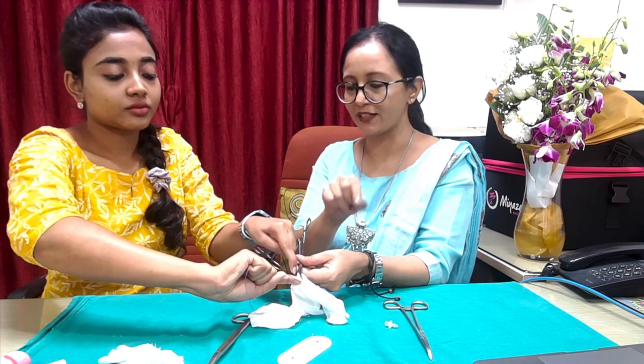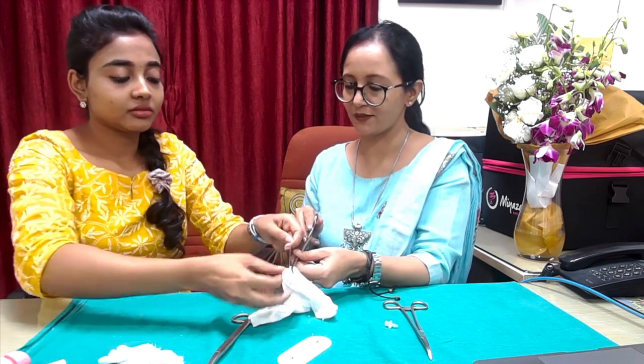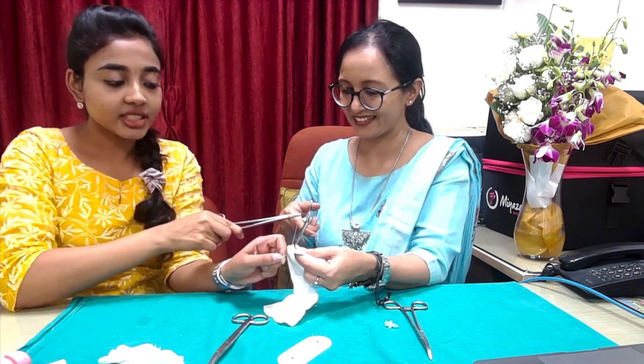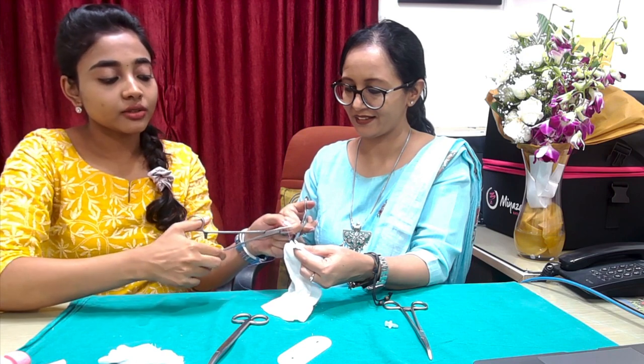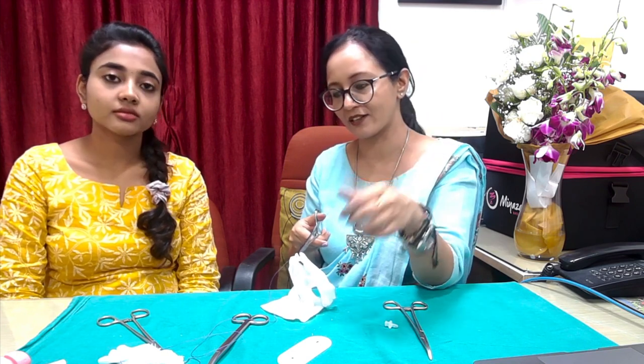Tighten the knot while placing your index fingers on it. Release the clamp simultaneously so the pedicle gets tightened. Give the knot a memory — count to 4 or 5. Without releasing traction on one end, place one more knot. The traction is still maintained on the knot, then rotate the shorter end above the finger, go beneath with the instrument, and place the second knot. Do this again for the third knot. Two knots for Vicryl are said to be enough, but three is common. The first knot is a double throw, second onwards a single throw. Then cut the suture.